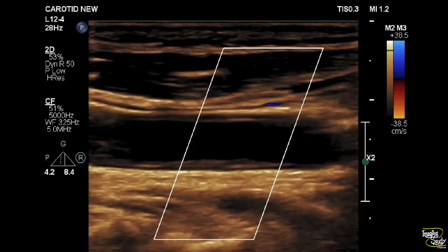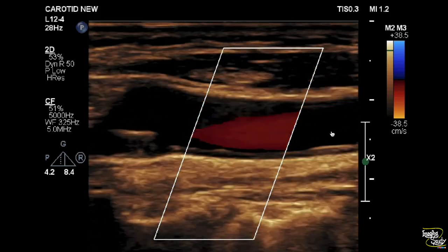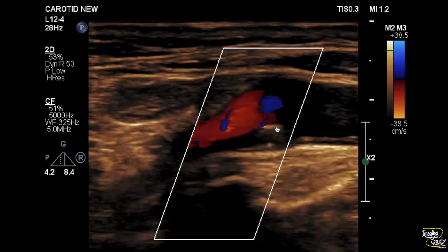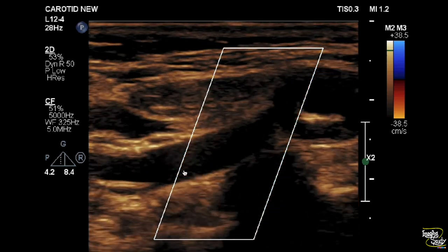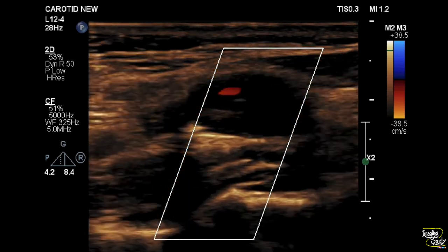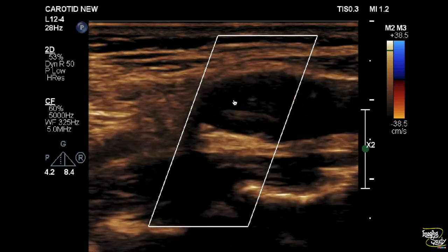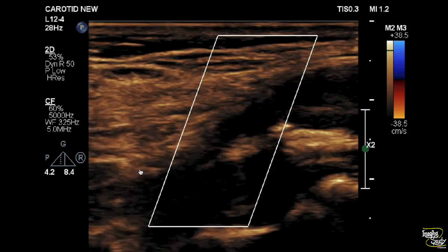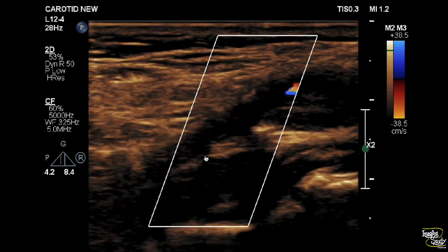Here is the left common carotid artery — you can see a good amount of flow. Here is the plaque causing narrowing of the bulb. This is the external carotid artery showing good flow inside. When we move into the internal carotid artery, you can see narrow luminal flow at the proximal part, but just after that there is no flow within the lumen. The lumen is completely filled with sonolucent Type 1 plaque.